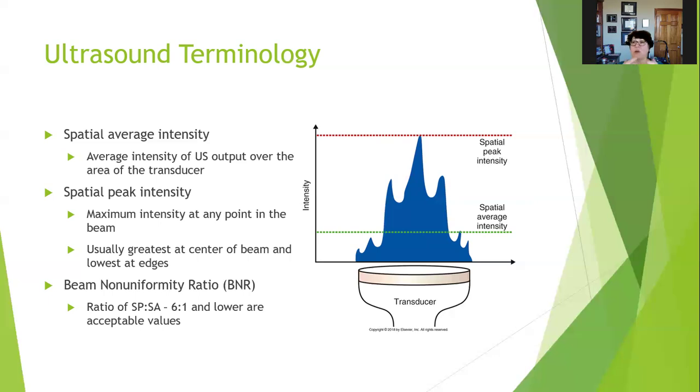So in the labs, we get our equipment serviced every year, and we just had the technician come and service our equipment. And most clinics do the same thing. The hospital-based clinic where I worked, they had a biomed team that serviced all the equipment. Some private clinics have a private company come in and do it. And basically, they come in and test all your equipment and make sure that it's working properly and that the beam non-uniformity ratio is acceptable. If it's not, then you have to retire the unit.